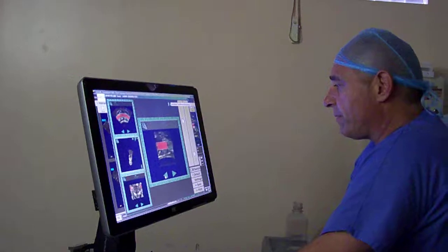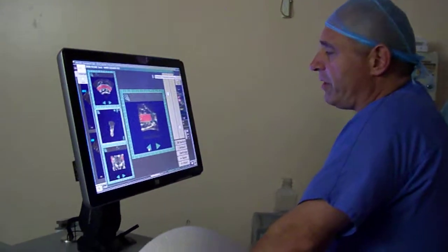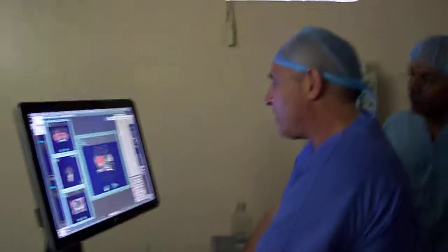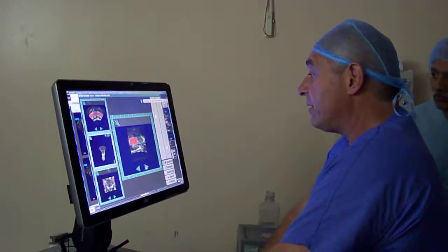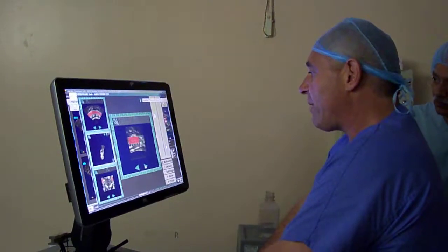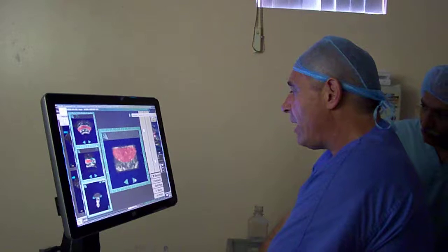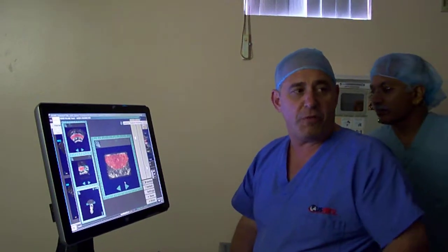You said the first couple images, right? Well, you want to make sure you include that area, but on the top, you always put some energy on top of the prostate anteriorly, and there's not a lot of consequence to that. So this looks very, very good. That's phenomenal. We've conformed the energy beautifully to the shape of this guy's prostate. We've been very accurate about it. We see it in 3 dimensions, and that is a very good three-dimensional plan. So now we'll just move into the actual treatment.